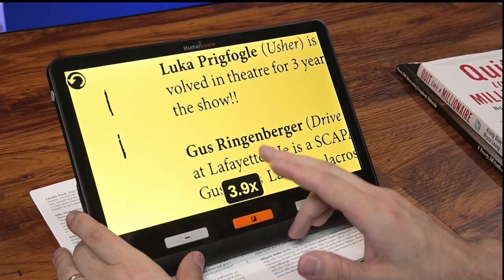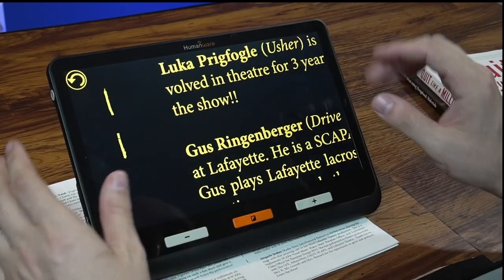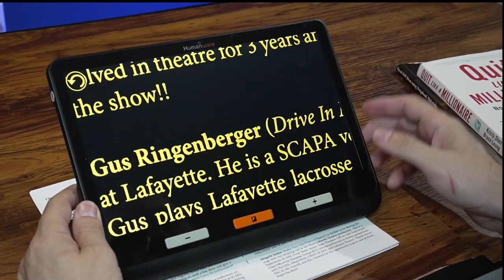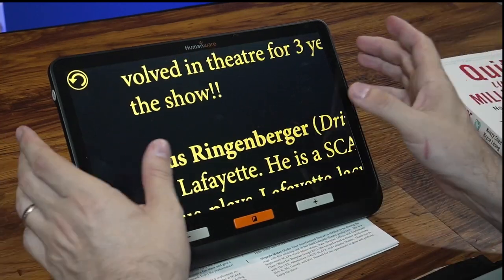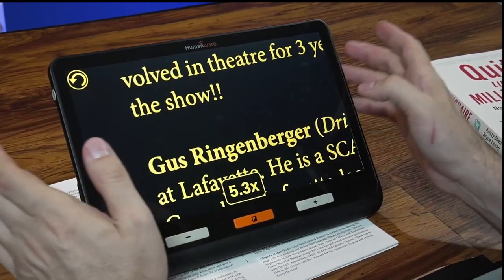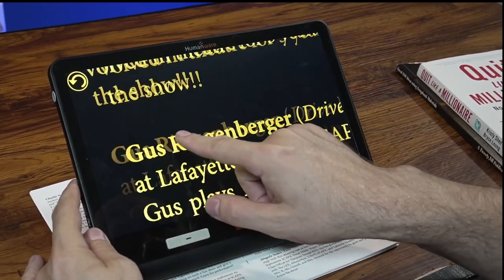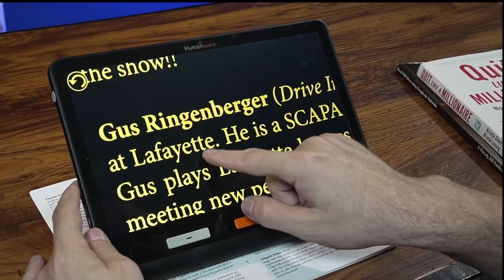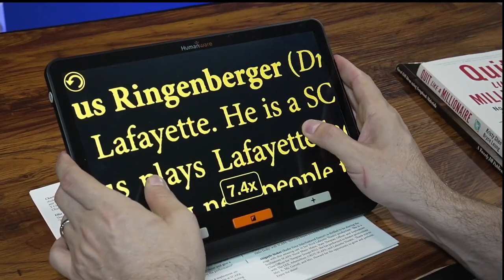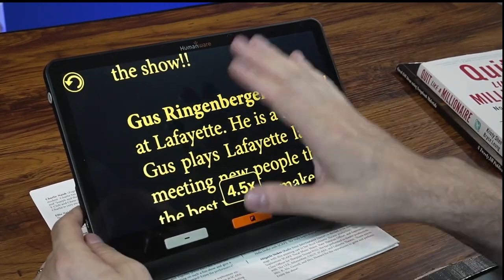It takes much longer to change colors on a captured photo than in live video, which is a little strange. In photo mode, when zoomed in, you can use your finger to pan around the screen using the touchscreen, and you can pinch to zoom in or out. It's not the most responsive touchscreen — your fingers move quite a bit before the image actually starts to zoom — but it's still nice to have.